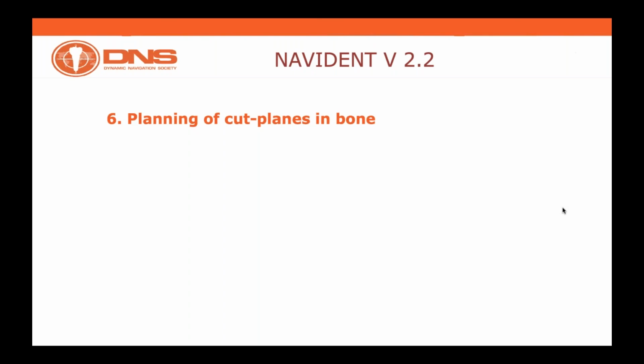And equally, as you've seen, we introduced a caliber, which is a very essential tool to communicate with the software, which is metallic, and that metallic allows it to be autoclaved, and therefore sterilized and used as a sterilized tool to calibrate the drills, to calibrate tips, to calibrate implants, and therefore guaranteeing the level of asepsis and sterilization which is required by the nature of a surgical treatment. So thanks, Dr. Bara, for this question, because it's more an observation.